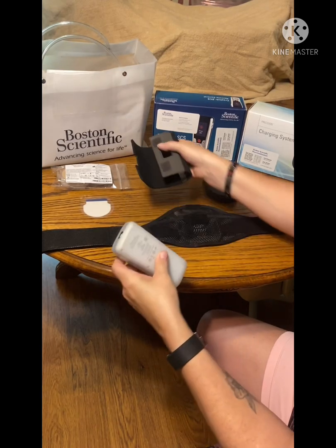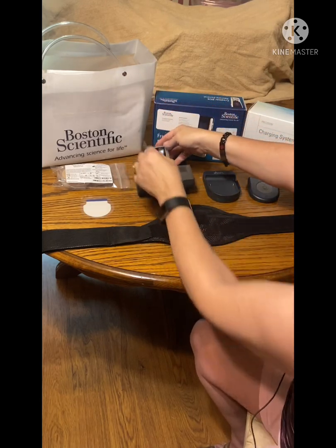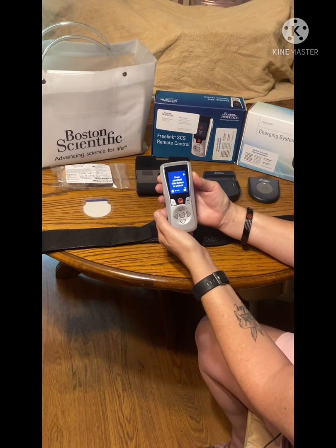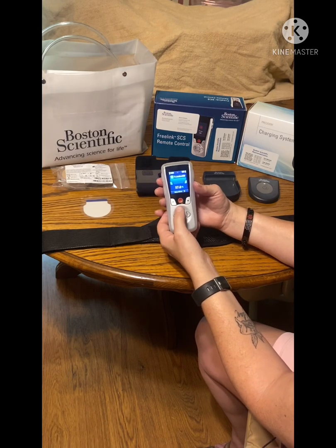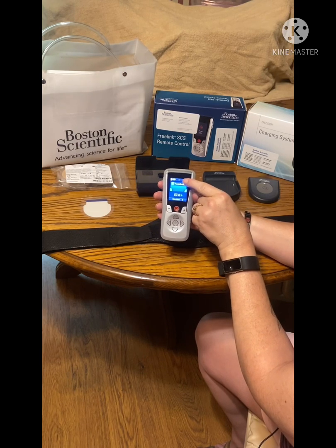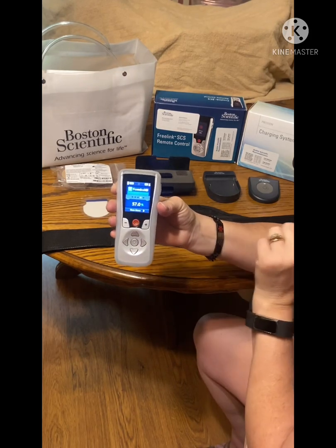To charge the generator that you have implanted — oh yeah, I forgot to show you — also if you need to turn off your stimulator to charge it, or if you're going through security or something, you just push this red button. I accidentally shut it off, so that's what it looks like when it's shut off. Just push it to turn it back on.